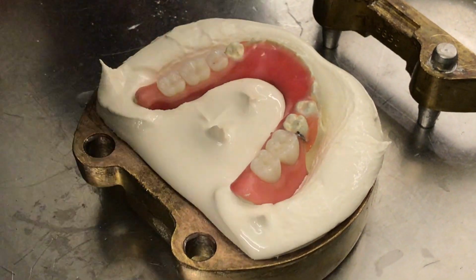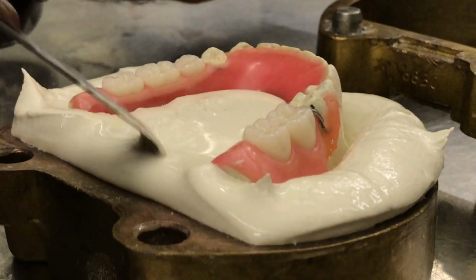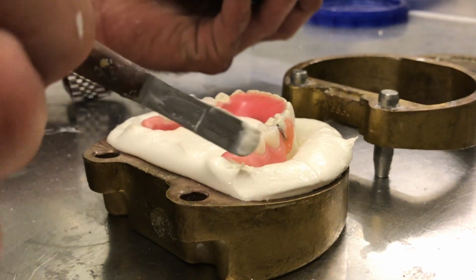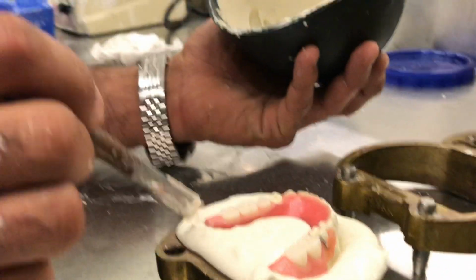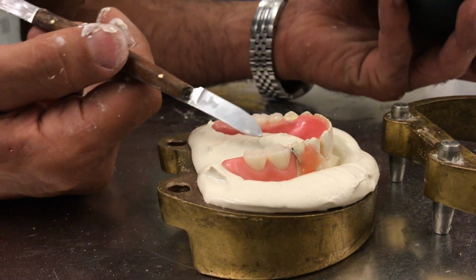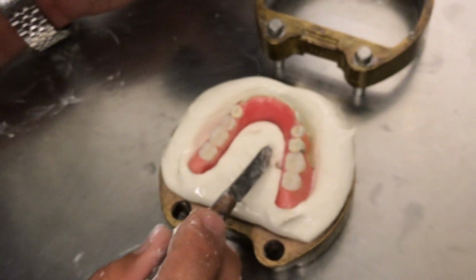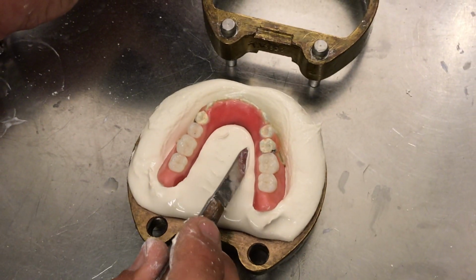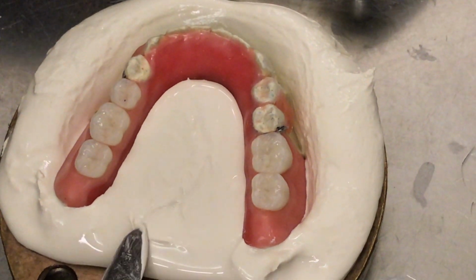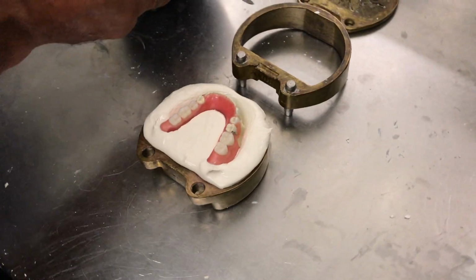Now, if I had gone a little bit lower with these retention prongs here, the less stone I would have to use. So keep that in mind when you're working on cases. The higher you make them, the more coverage you need to have with your stone, and it becomes more difficult. Imagine now this wax is going to get boiled out. A, it becomes more difficult to boil the wax out, and B, it becomes difficult to separate the case and pack the case. So you can't have those projections too high off the model floor, so to speak. So that looks pretty good.